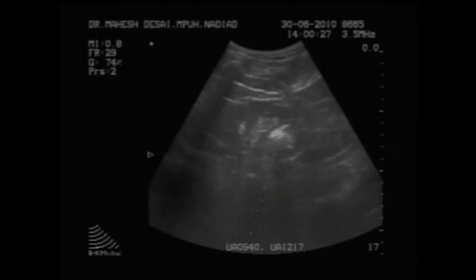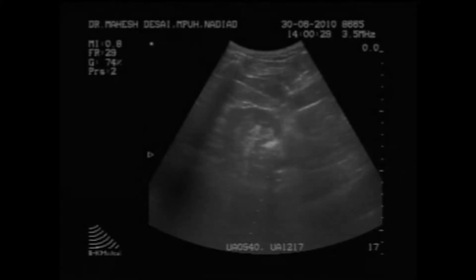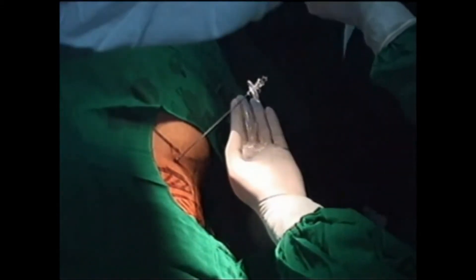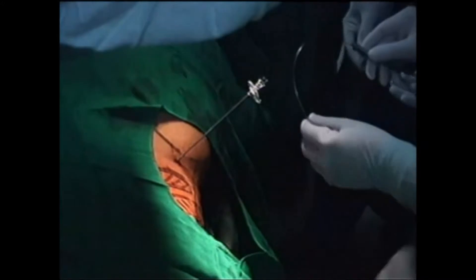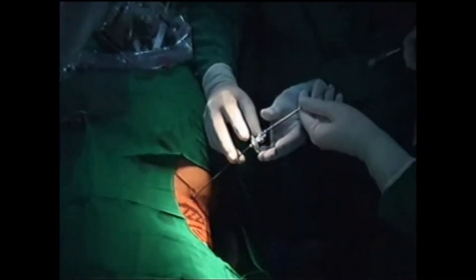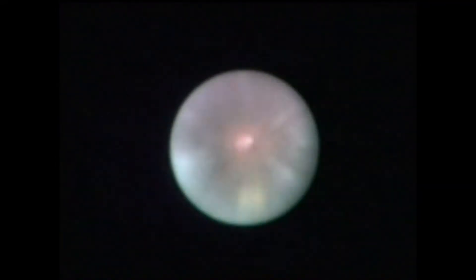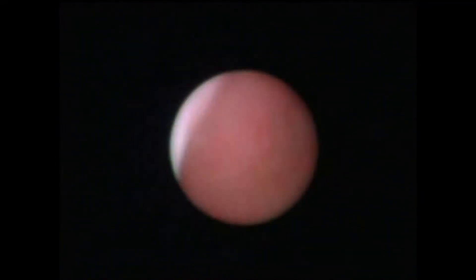Ultrasound-guided caliceal puncture is performed using a 16-gauge microperk needle. The puncture is confirmed using a contrast study and return of clear irrigation from a 5-French ureteric catheter. The 0.9 mm flexible microperk telescope is introduced through the stilette via a 3-way connector.